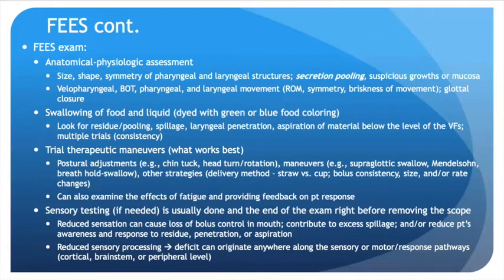During the swallowing of various food and liquid consistencies that are dyed with green or blue food coloring for optimal viewing, you might look for residue or pooling, spillage into the laryngeal vestibule, laryngeal penetration, aspiration of material below the level of the vocal folds, and you might look at multiple trials for consistency. Obviously, you won't have them aspirate repeatedly. If there is aspiration, you will stop those particular consistencies and perhaps try something else or perhaps a maneuver.